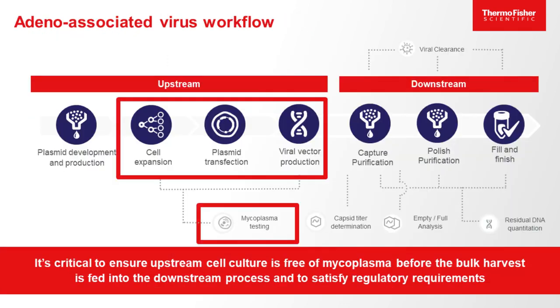Taking a look again at our AAV production process workflow, it's critical to perform mycoplasma testing in the upstream bulk harvest material prior to progressing through the downstream process. Ilaria will now walk us through the mycoplasma testing process.